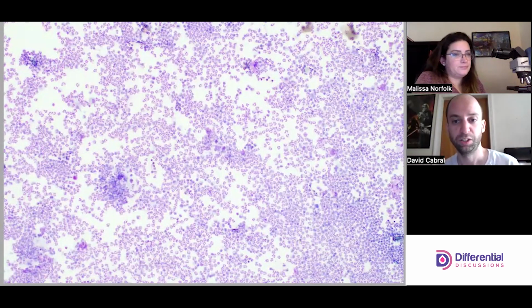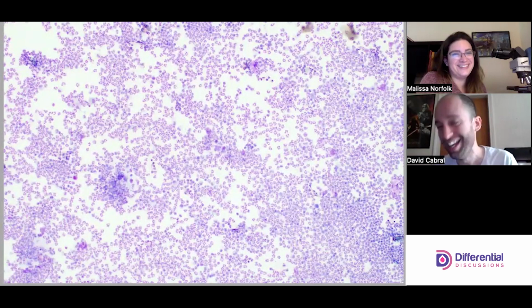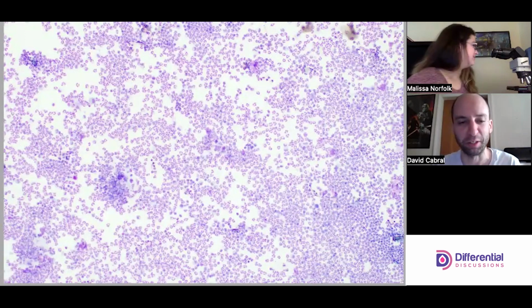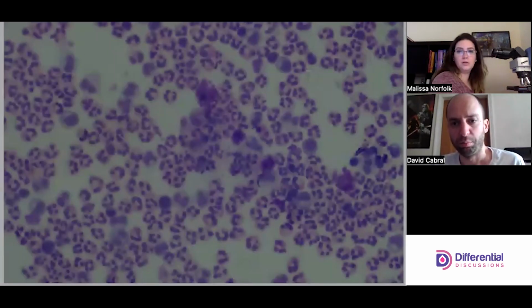Even with peripheral blood smears, you can generally get a relatively okay correlation between techs doing counts, but with body fluids, there's a wider variability in what you're going to find for the diff result. Agreed. Sometimes it's a skill thing, and sometimes it is just the area. The messy areas can be tricky. All right, want to pop down to 40? Let's do that.